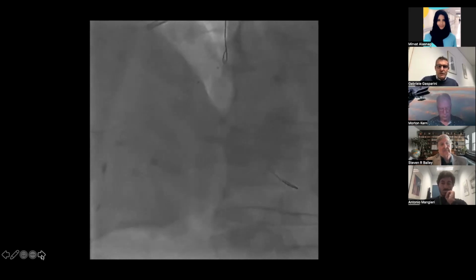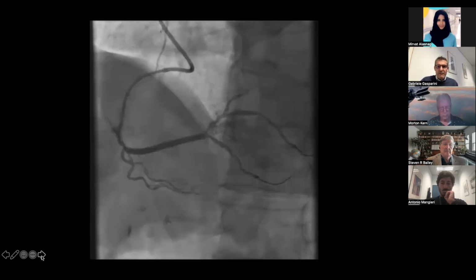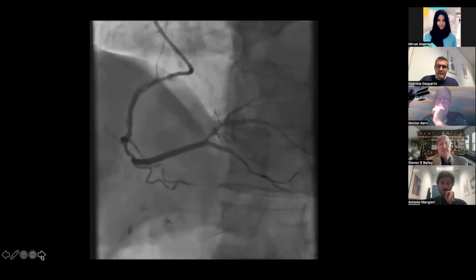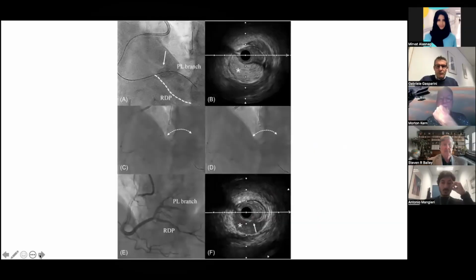So maybe you can show also the picture with the IVUS. This is the final result, with a complete restoration of TIMI 3 flow in all the distal vessel, the PDA, then the 2 posterolateral branches as well.